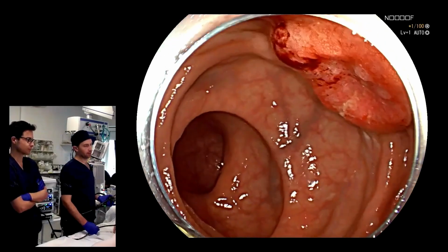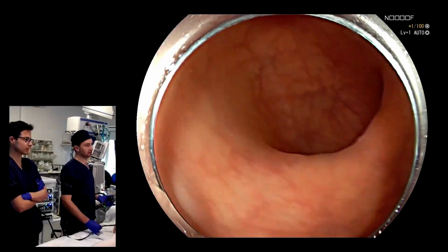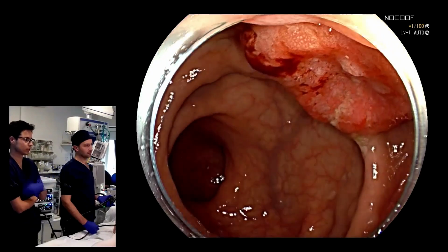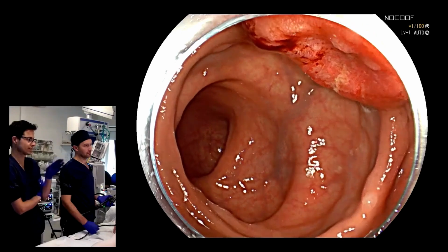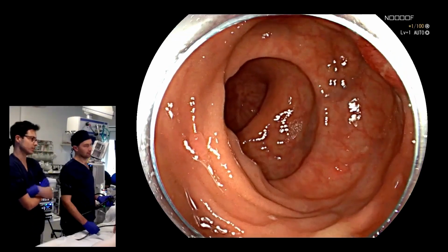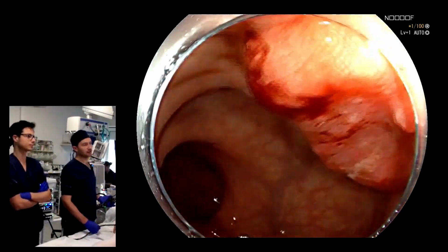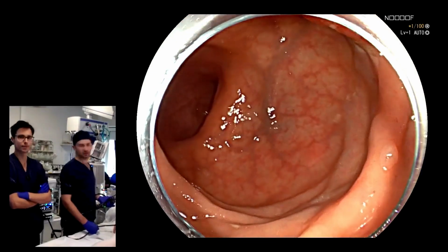And the posterior aspect of it versus anterior, how can we infer that from the position of the fluid, or is there another way that people need to think about that? Yeah. I think the easier thing would be, but not in this case, to put the patient onto his back if you want to confirm, and you will see the water going to the posterior wall. But if you think of the image as a CT scan image on the axial view, you can infer the position. Nice explanation. And what relevance does that have for this lesion? Why are we going on about that? Well, the relevance is in terms of resection, because posterior is much safer to resect than anterior.